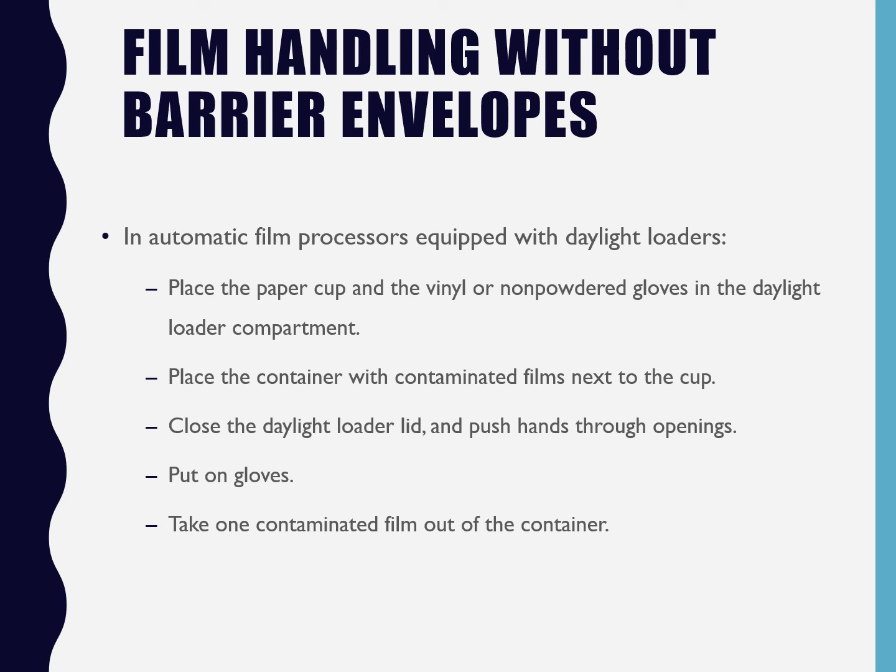Versus the way that we do it because we're a school. Sometimes students make the mistake of either going in with contaminated gloves or coming out with contaminated gloves, and because of that, I don't want any of you to be exposed. And so, for the purpose of this, you would put all of your items inside. You close the lid. You put your hands through. You put those gloves on.